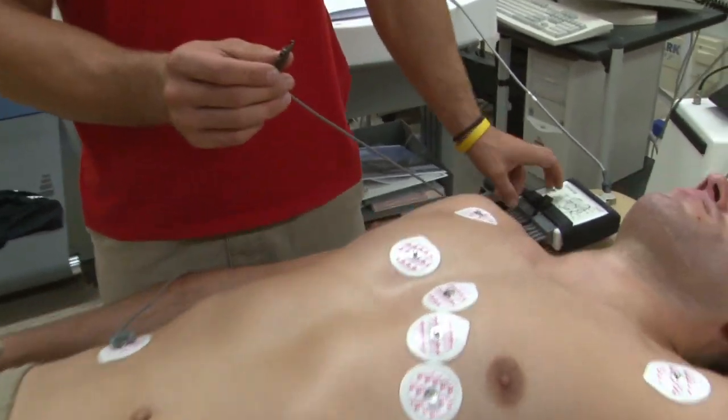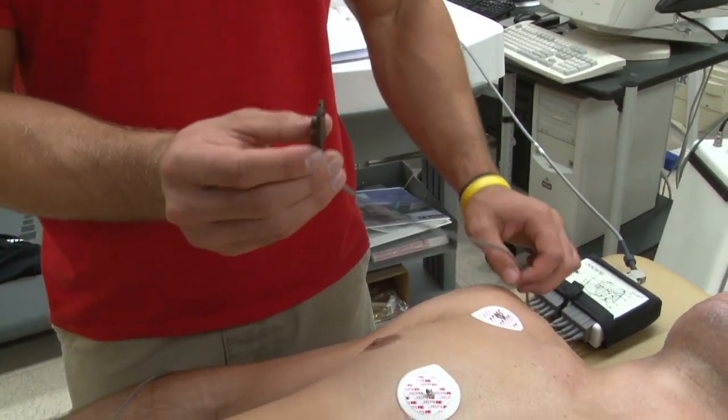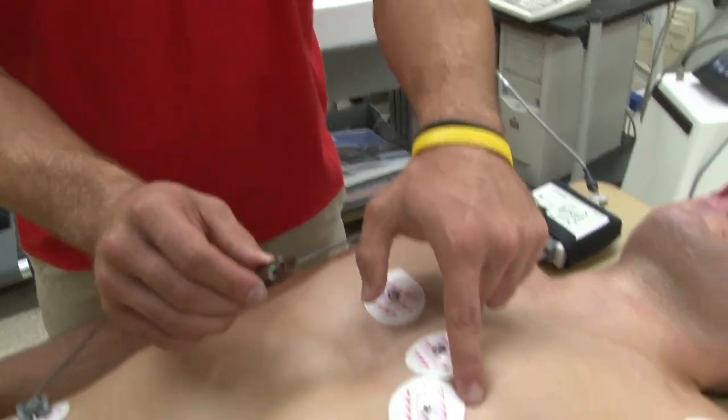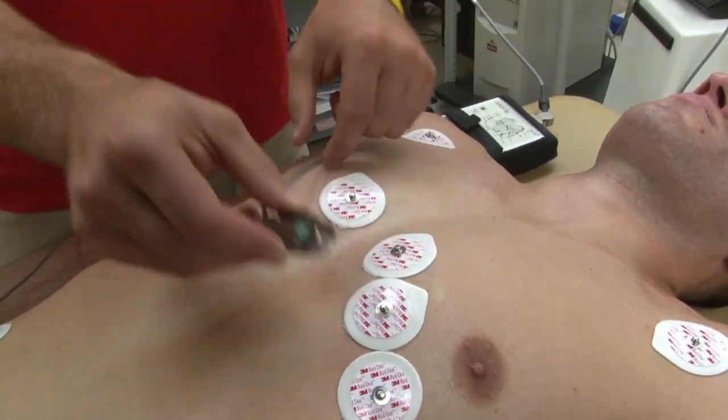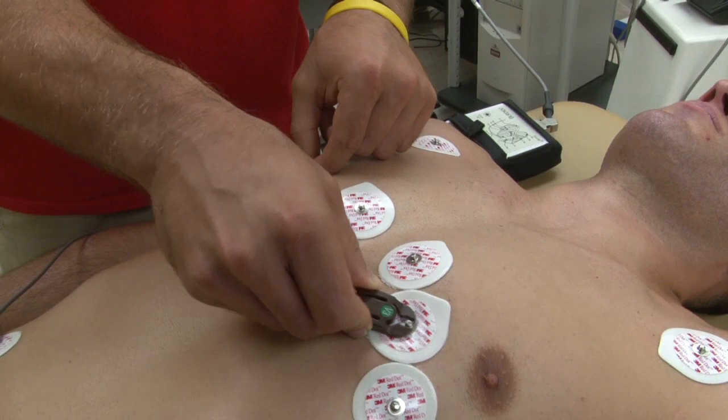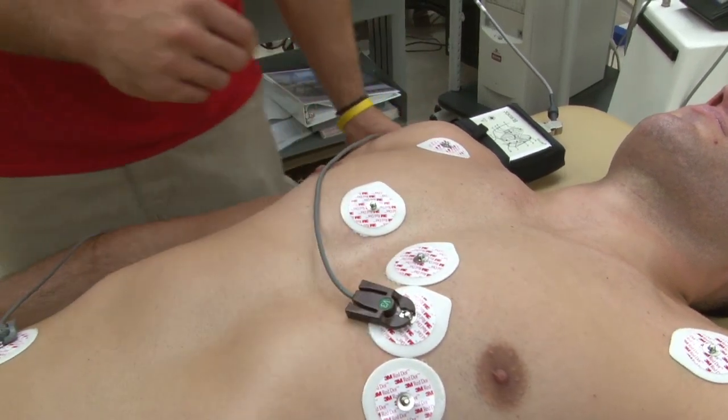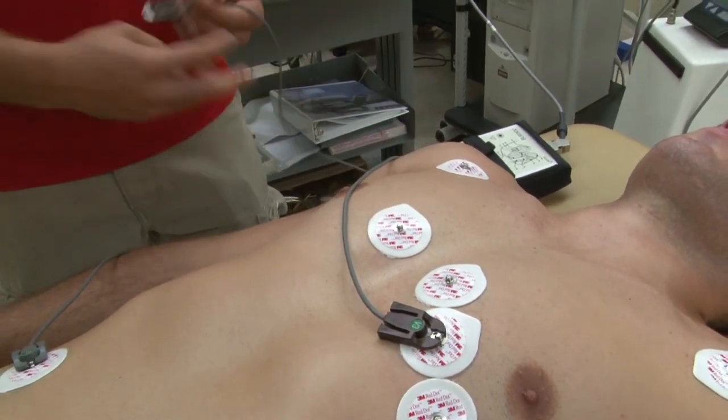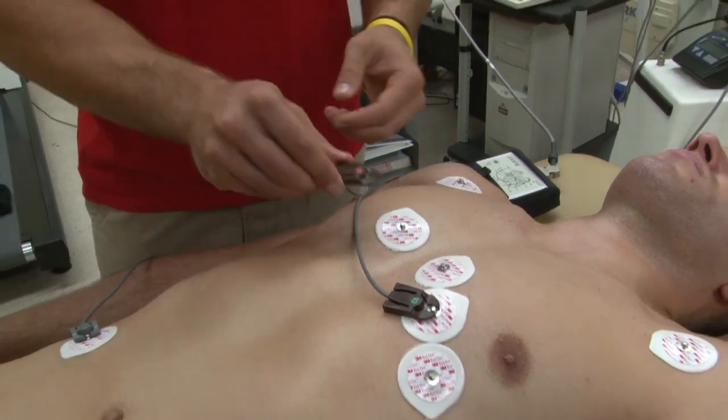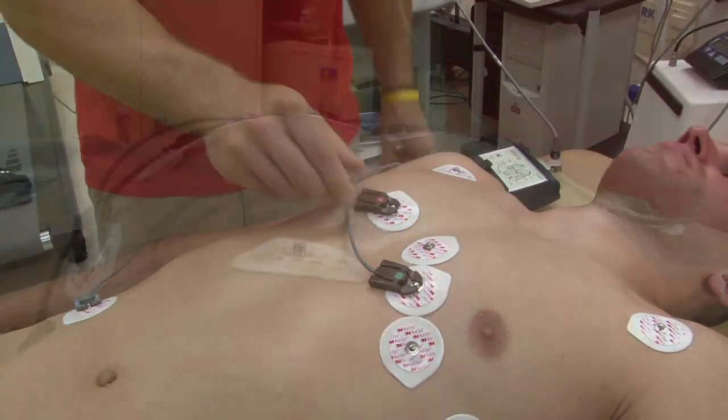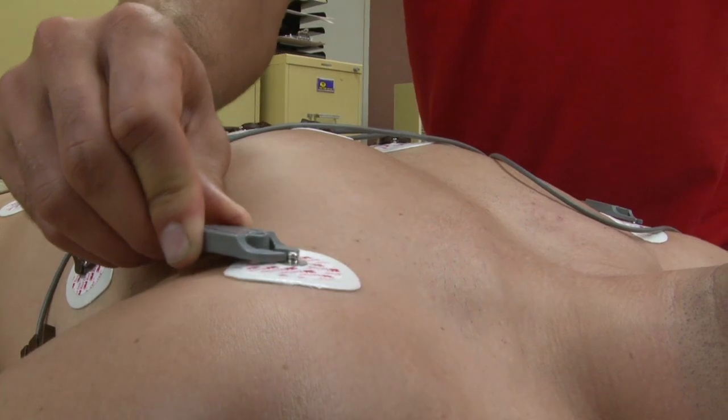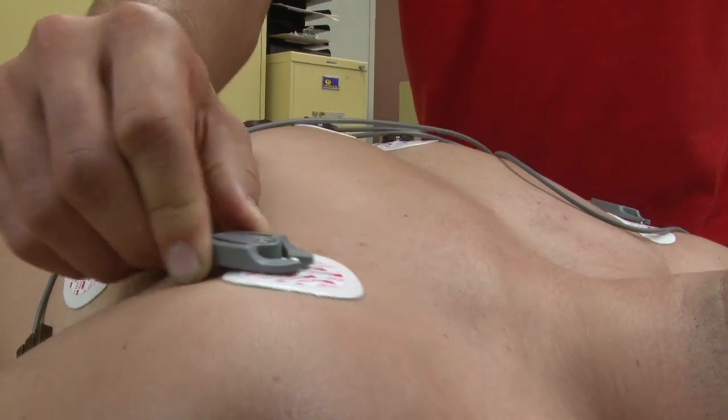And this wire says V3, so as you remember V3 is in between V2 and V4. This is V1. And that is how you apply 12 lead ECG.